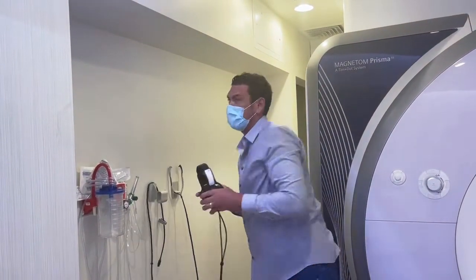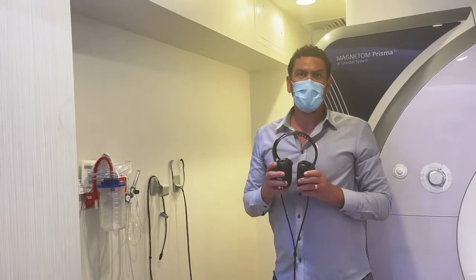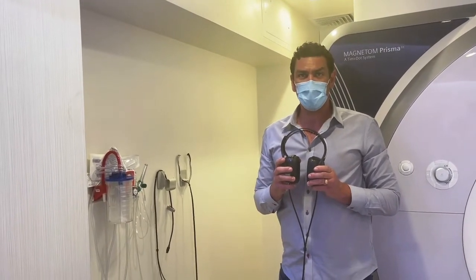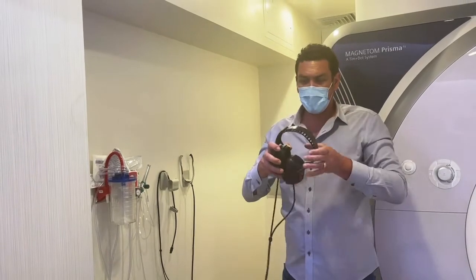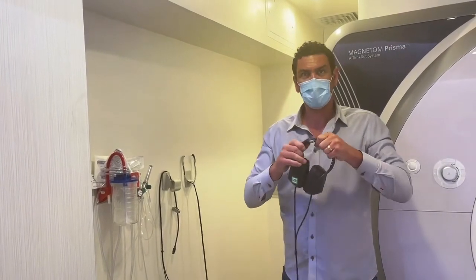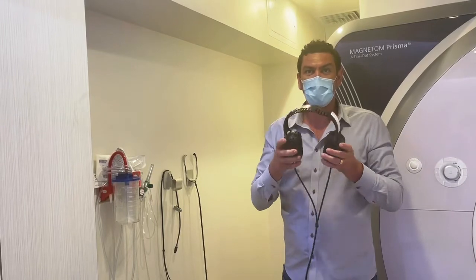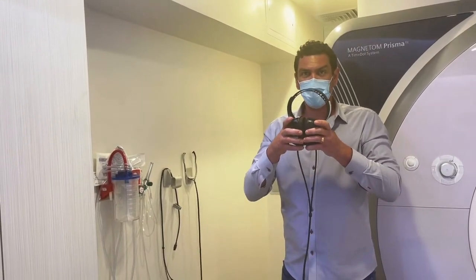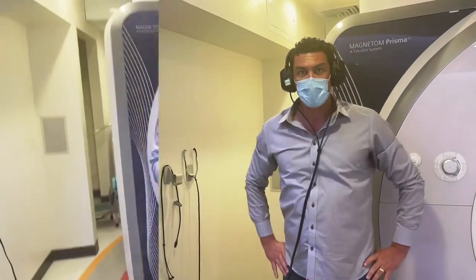Our over-ear headphones also provide patients with 29 decibels of hearing protection and do not require ear plugs. They have an adjustable headband and fit all size heads. To use them, open them up and put them over the patient's ears.